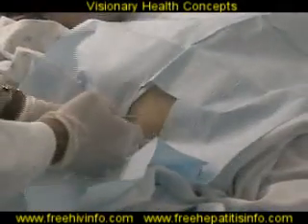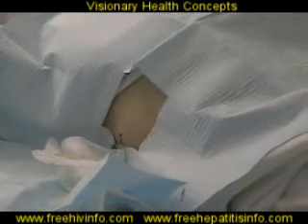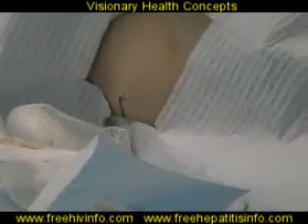Now we make a small stab wound with the tiny scalpel to make the needle slide more easily. There's no pain involved in this, as the skin has been totally anesthetized by the lidocaine that we used before. Now the biopsy needle comes in various shapes and sizes. The one that we prefer to use is called Jamshidi, but there are various other kinds of biopsy needles that are used in different hospitals.